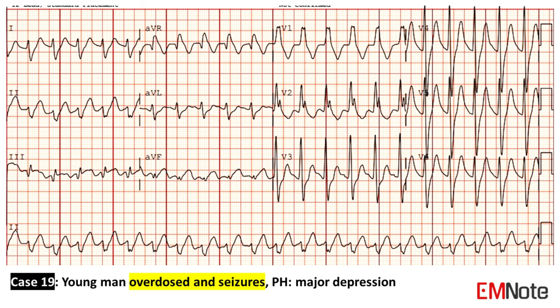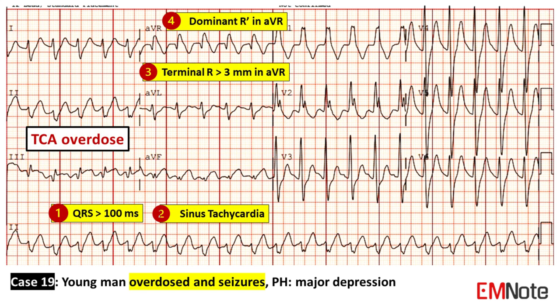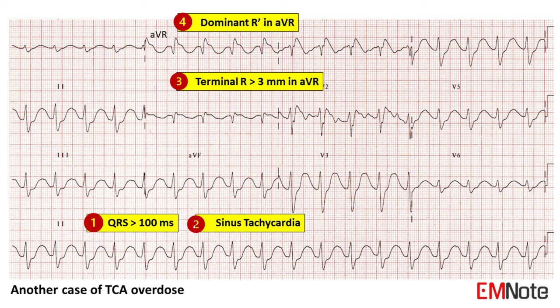Case 19: The patient is a young man with major depression, presenting with drug overdose and seizures. The ECG shows several findings compatible with tricyclic antidepressant intoxication, which include QRS above 100 ms, sinus tachycardia, terminal R-wave greater than 3 mm in AVR, and dominant R' in AVR.